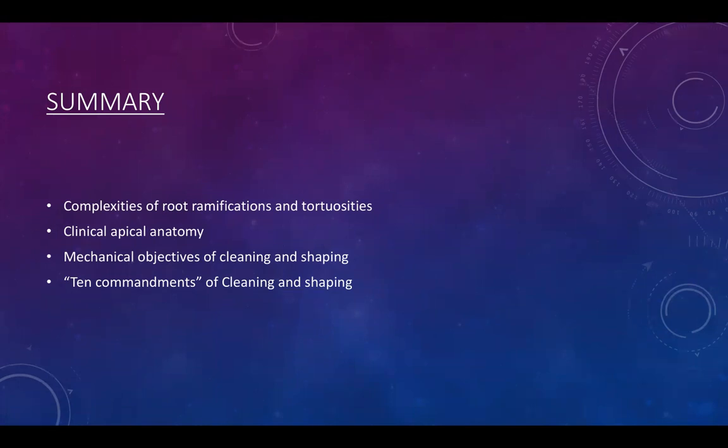And last question is, the envelope of motion is defined as the up and down stroke push and pull motion for the purpose of. The correct answer is A, establishing apical patency. We do typically do that within 0.5 to 2 millimeters of stroking push and pull motion with some rotation when we're taking it out to get some of the debris out. But this is mainly to establish apical patency, and if we can't really reach the apical ends, we use this method to try to reach the apical ends.